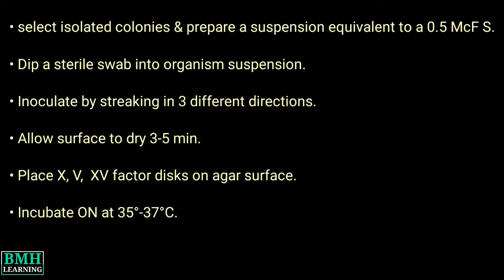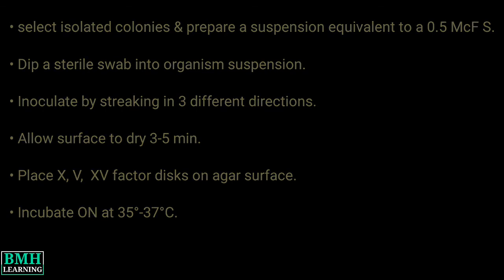Allow the surface to dry for 3 to 5 minutes. Place the X, V and XV factor discs on the agar surface. Incubate overnight at 35 to 37 degrees centigrade. Observe for growth or no growth around the discs.